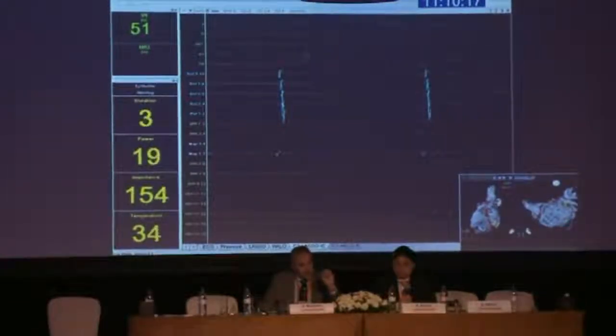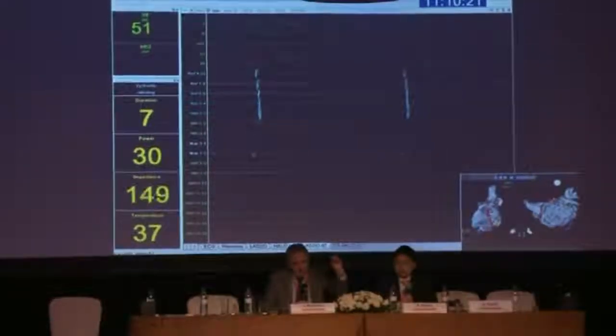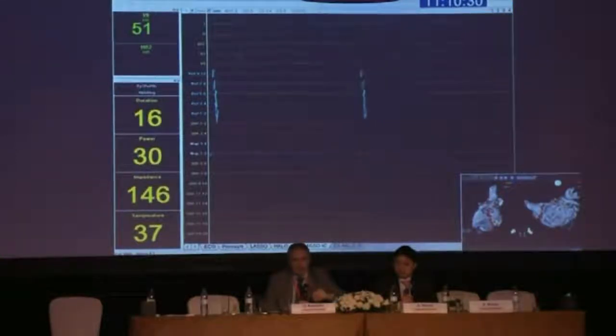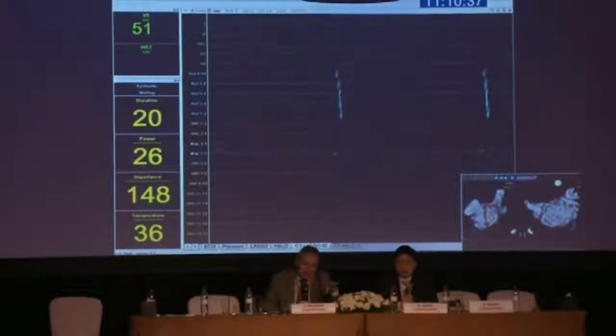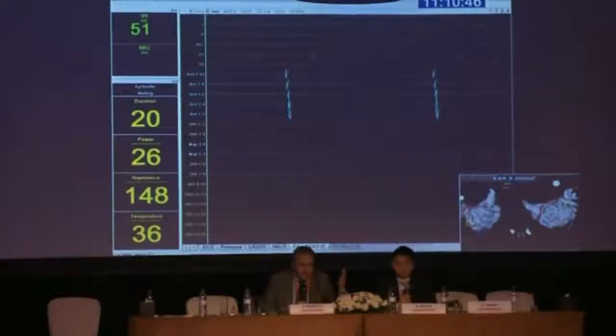In other words, it's better if you do isolation of pulmonary veins to start somewhere and go step by step around, not to start somewhere up and down and move from one area, one quadrant, to another quadrant. This was, of course, post-hoc analysis, but I think it has some relevance. Maybe you create edema if you apply somewhere, and then you cannot do successful ablation in the same spot if you come back later on.